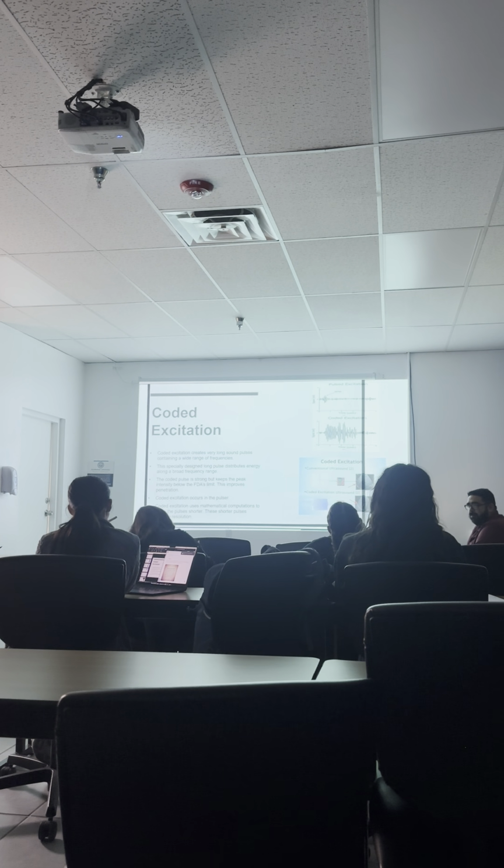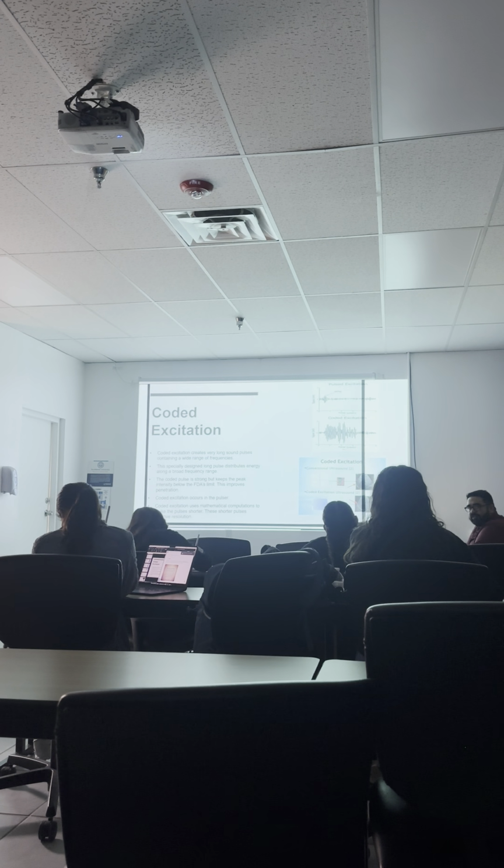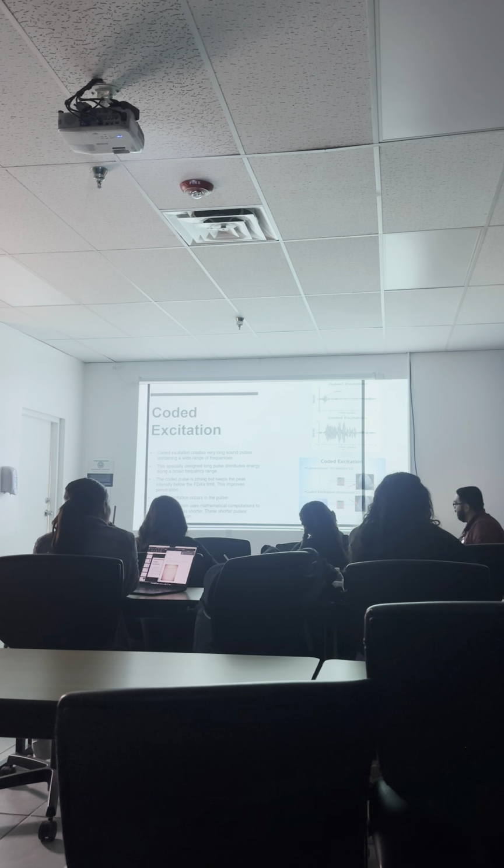Penetration, okay? So, the coded excitation occurs in the pulser. What makes the coded excitations? The pulser. Does everybody understand that? What else does a pulser do? The amplitude. What else? PRP and PRF? Yes. Are you sure? Alright, just making sure that you're sure.